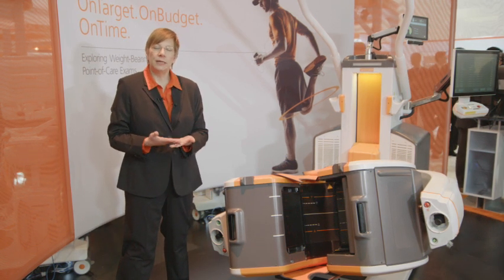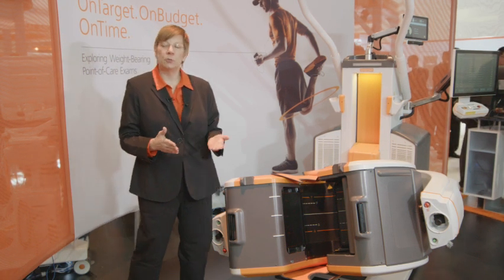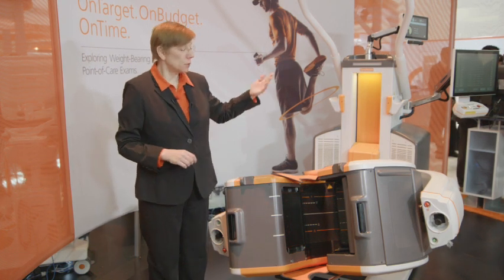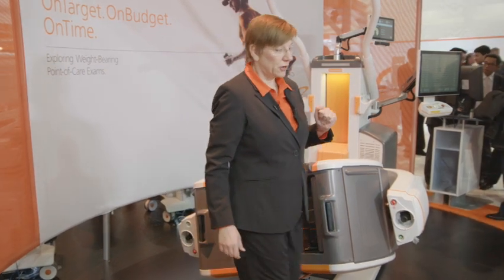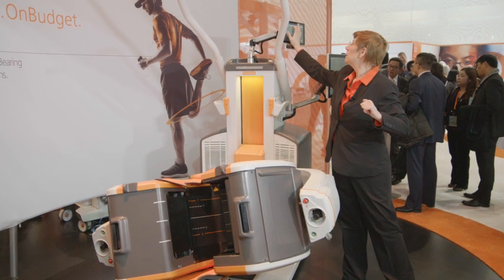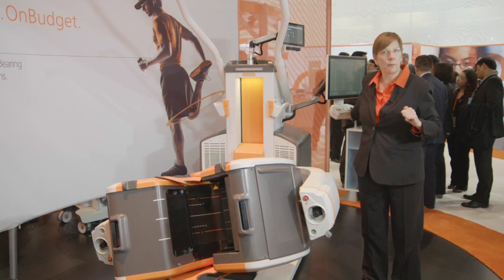So we can do knees and ankles and feet. However, we've also made it possible to do sitting exams for those patients that can't stand. Those have separate auto positions, which we can select over here, and then move the system into the proper position.